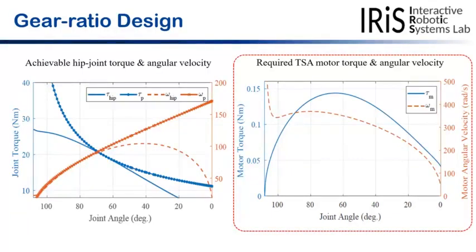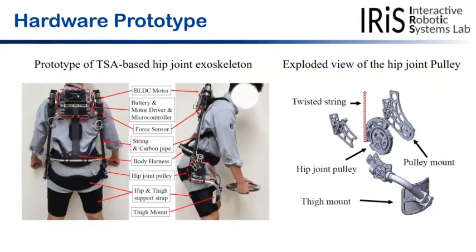The developed exoskeleton has a pair of TSAs that is located beside the hip joint starting from the back of the shoulder. It contains harness and mount for supporting upper body, hip, and thigh.